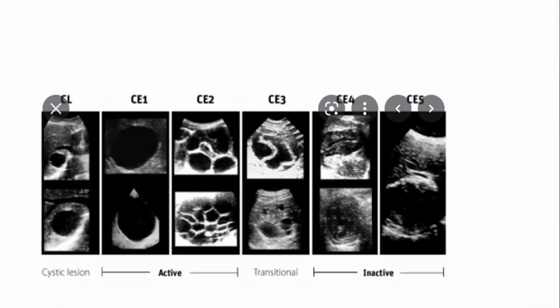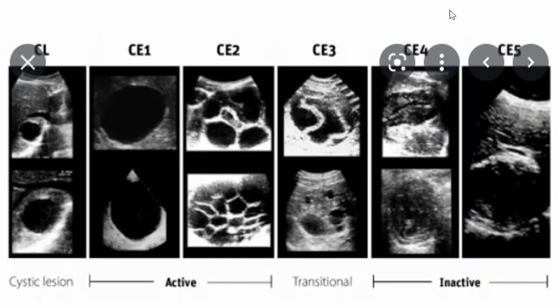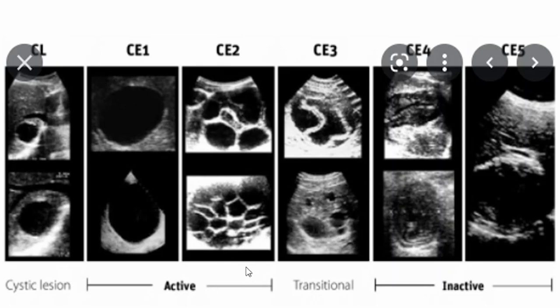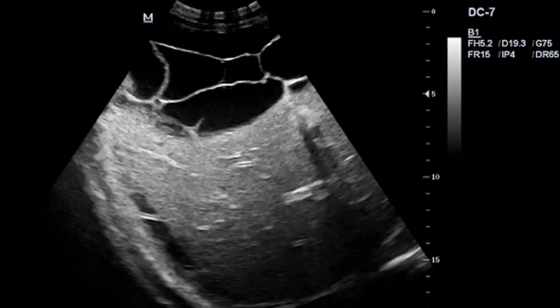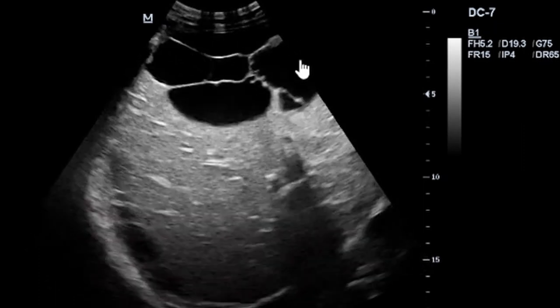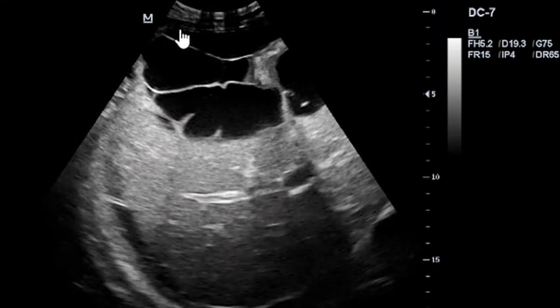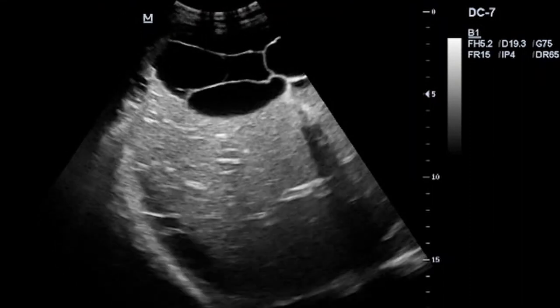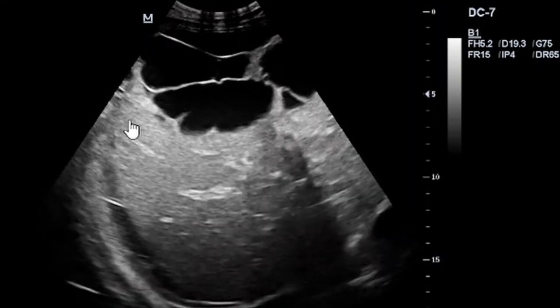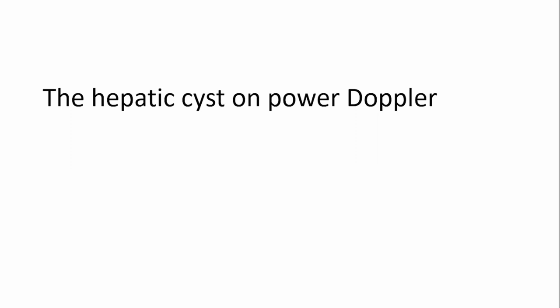Following the previous demonstration, you can see this corresponds to CE2 classification — our echinococcus cyst was in the active stage, resembling the fishnet or honeycomb appearance. The cyst had septations affecting what appeared to be segments seven and eight in that region. Let me play it again so you can see the hepatic cyst on power Doppler.